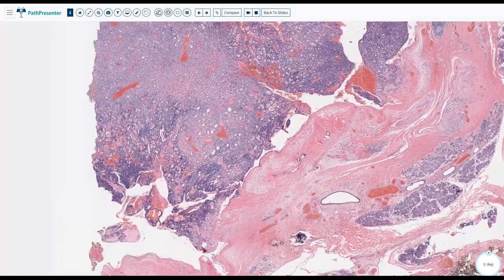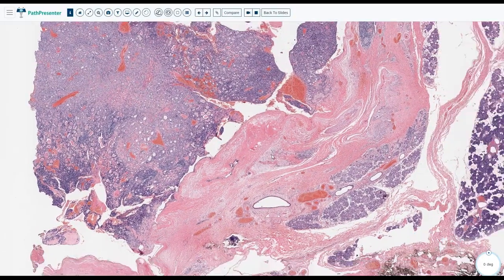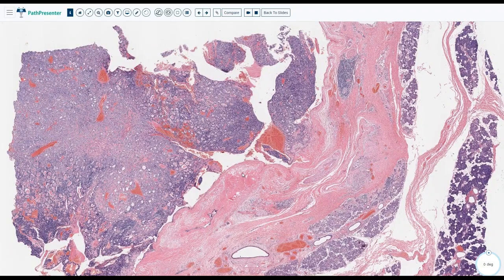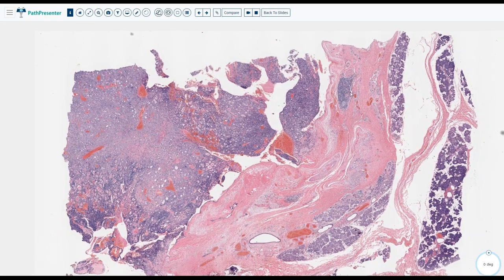So this is the next case. Again, it's salivary gland. It is encapsulated, and sometimes it has very... I remember a case I had a few months ago. Most of the lesion is fibrotic, barely will you find some areas, it's like even falling apart. The area is proliferative. I think it has to do with some cytokine or something that the tumor or the body is reacting against, and starts or initiates a fibrotic reaction.